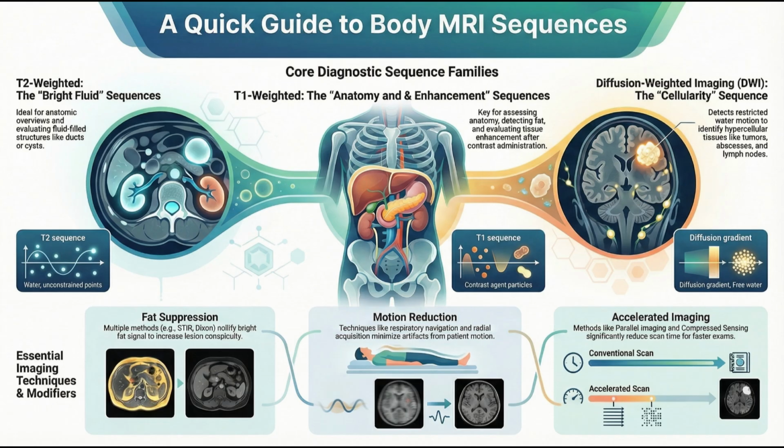And then there's the Dixon method, which has become incredibly popular. Dixon is probably the most versatile and robust modern method. It's based on the chemical shift between fat and water. You get an in-phase and an opposed-phase image, and then from that, the scanner calculates a water-only, your fat-suppressed image, and a fat-only image, all with no extra time penalty. And the robustness of Dixon's water-only images is key. It's fantastic, especially in, say, obese patients, where the B0 field is really inhomogeneous or near areas of susceptibility. Plus, it's invaluable for characterization. You can look for microscopic fat with the opposed phase, or use the fat-only to perfectly outline a myelolipoma. It's just incredibly powerful.